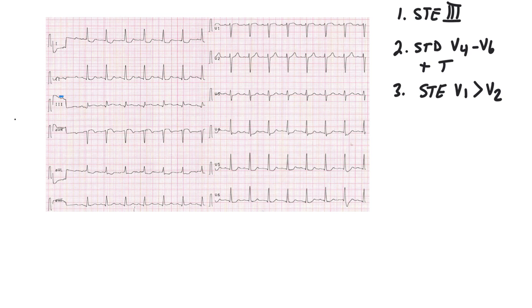ST depression in leads V4 through V6 with a positive terminal T wave. And then subtle ST elevation in V1 that exceeds what is seen in V2. Let me just make this a little smaller here. So let's go ahead and take a look at this ECG. All right, so let's take a look at lead 3 here. And you can clearly see that there is some ST elevation in lead 3. It's a little subtle, but it's there. And I do not see any other ST elevation in the inferior lead. So lead 2 looks okay. There might be a little bit of depression there. And the other major inferior lead, AVF, looks roughly normal, the J point at least. So only 3. So 3 is the only inferior lead where we see the ST elevation. All right, so check. ST elevation is present in lead 3 and lead 3 only.